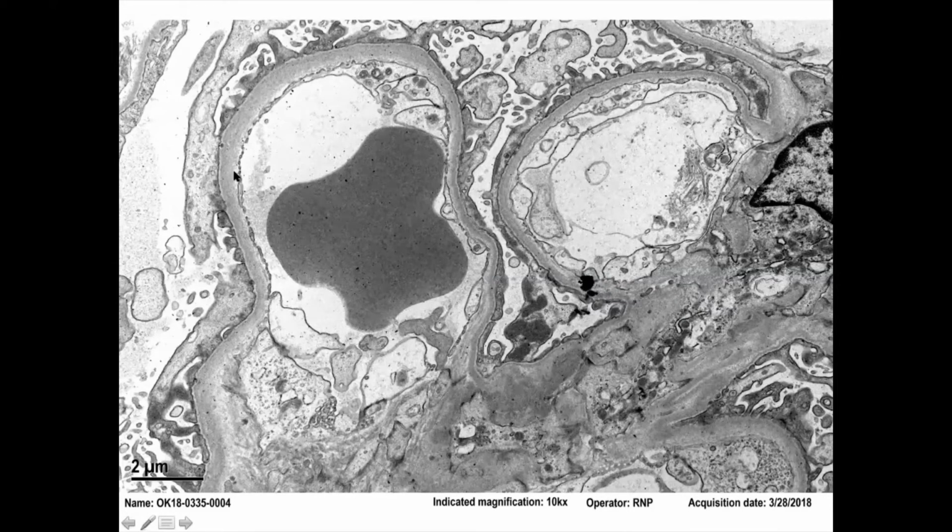بودوسايت. اوكي, انا اقول البودوسايت احنا كلنا نعرفها, هاي كانها صبعه هاللون. انزين, هذه activated البودوسايت, we have microvillus formation وكل البودوسايتس هني. فاذا البودوسايت برا معناته هذا الجلوميرولار this is the glomerular basement membrane, معناته هذين الاندوثيليال سيلز, صح؟ وهذه RBC داخل اللوب. معناته إن هني هذا اللي between the loops is actually the mesangium, وهذه الخلية اللي فارشة روحها, اللي spreading itself is the mesangial cell.